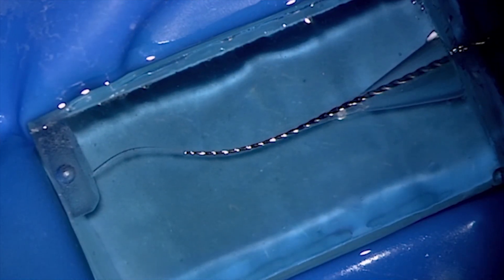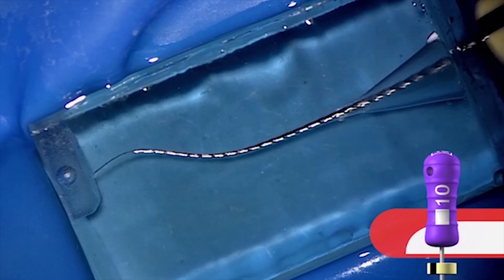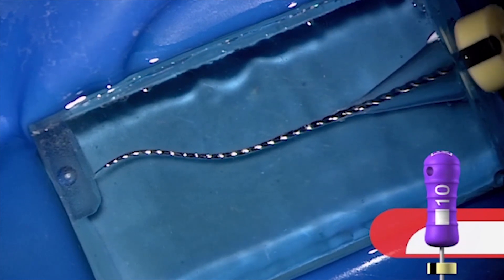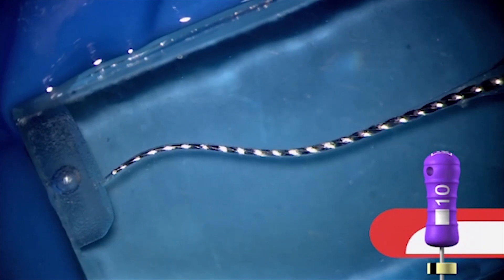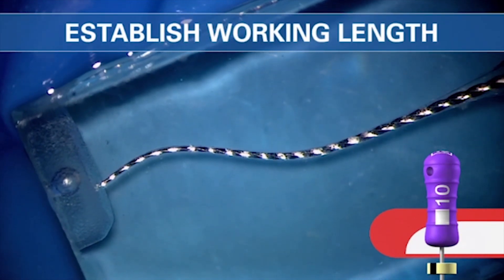Here comes our 10 file. Notice the rubber stop — it's doing very small back and forth reciprocatory motion. It's not really making a big motion, just a small back and forth rocking. When you get that file down the canal and get about a half or one stop short of length, let's not reciprocate the handle more so we don't transport. Let's just slide in — slip and slide. By slipping and sliding to length, we are now able to maintain the position of the foramen. That was a critical objective in the Schildarian idea of mechanical objectives for shaping canals.